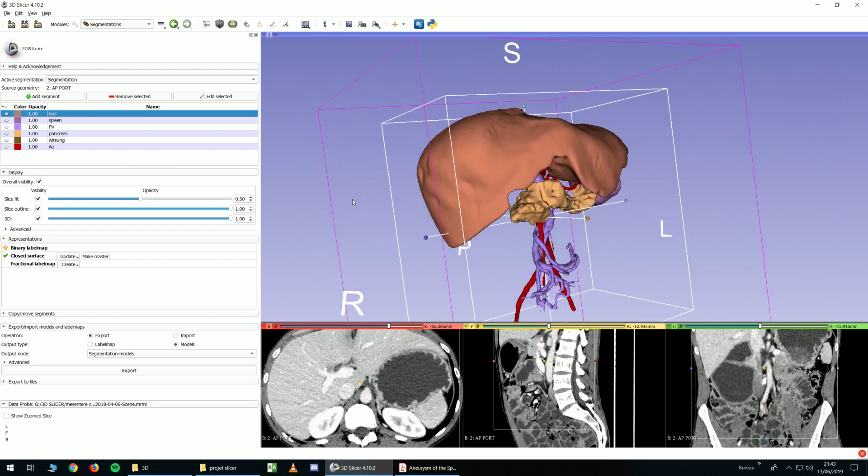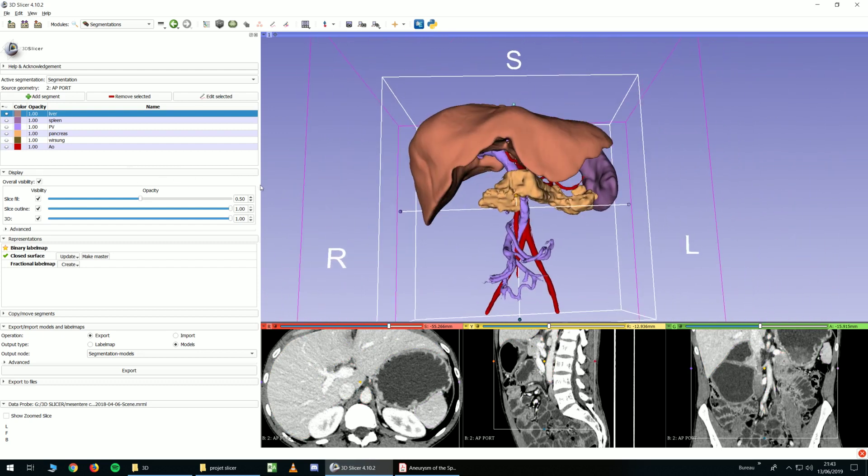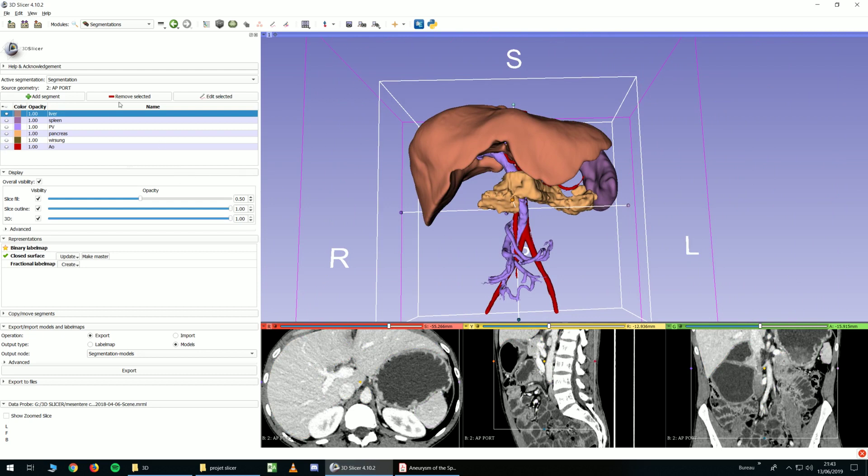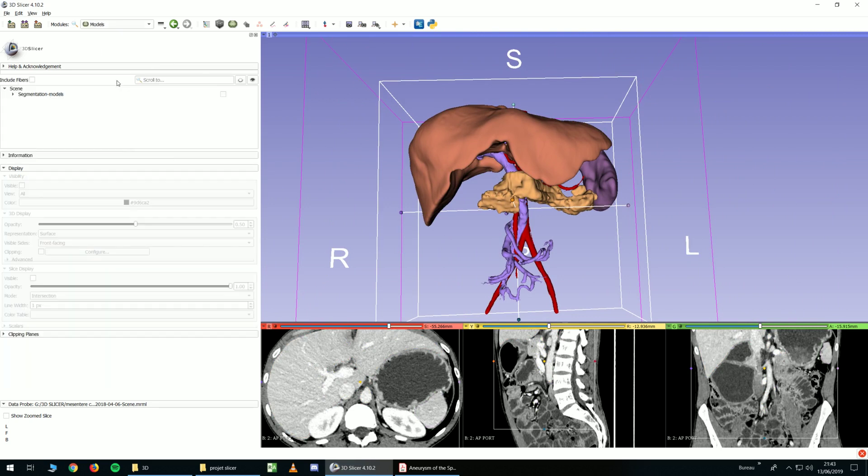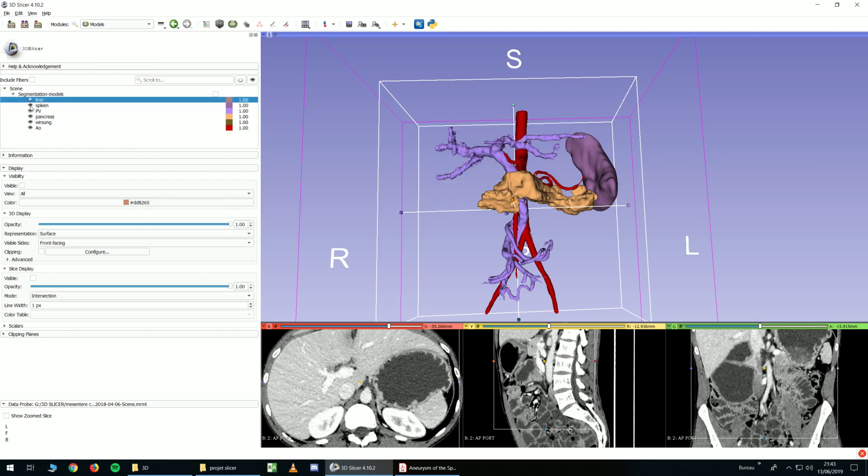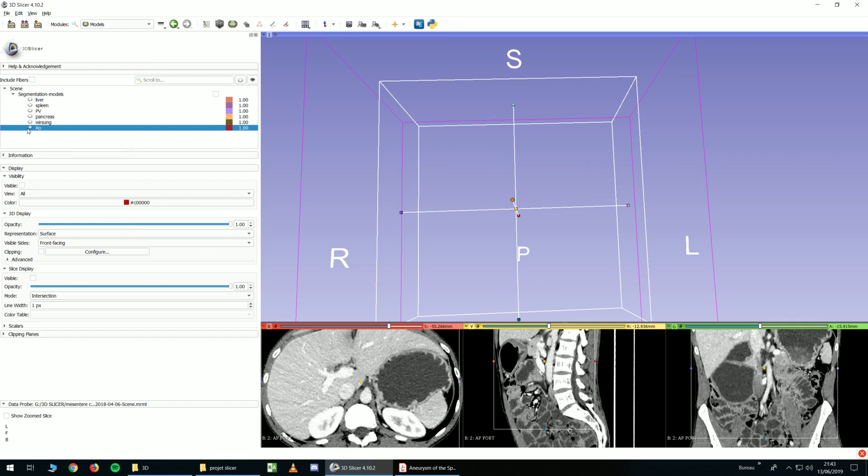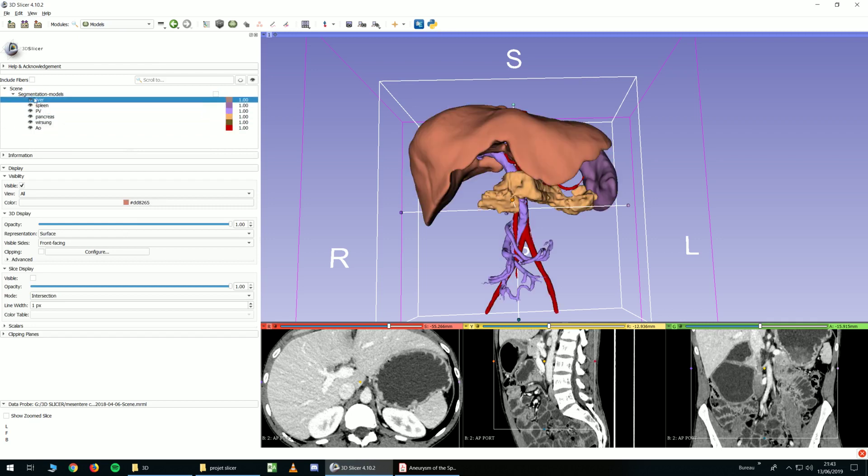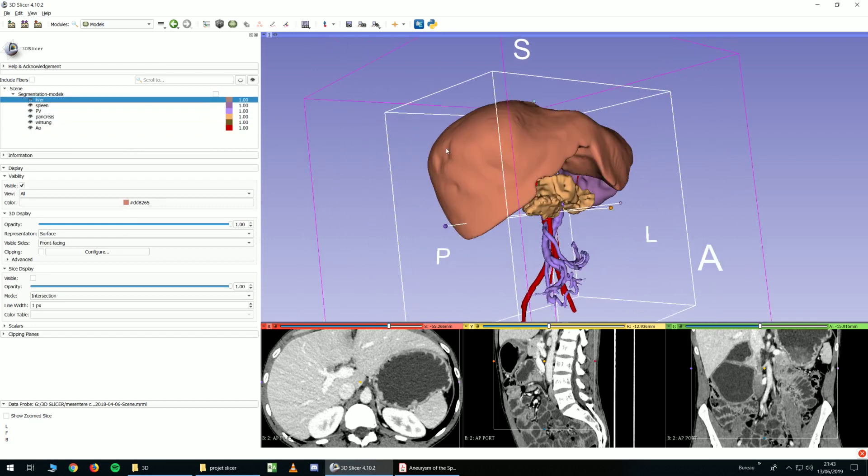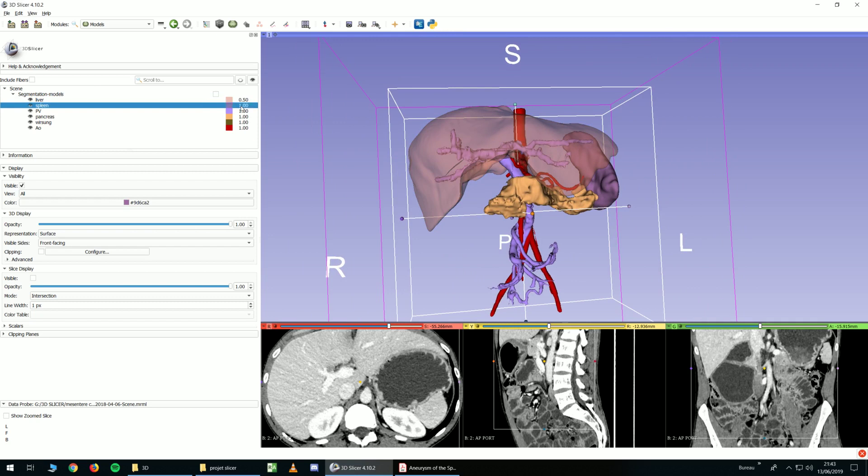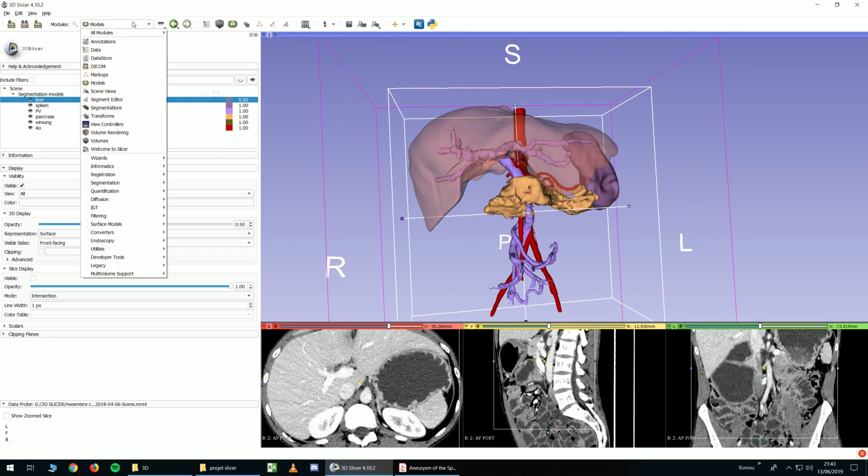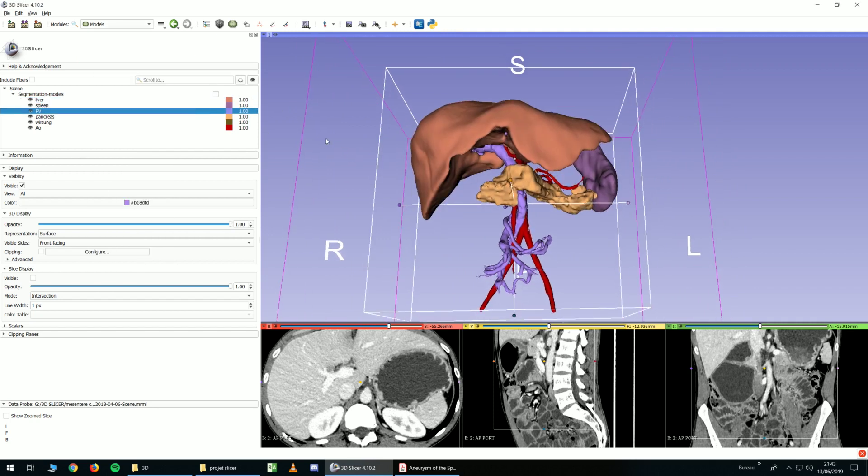you can see it is still displayed. So now you go in models and you have a new segmentation model and you have everything in here. So you just created your models. Now you can change color or opacity for example. You could do this even before in the segmented editor. So let's set to normal opacity.